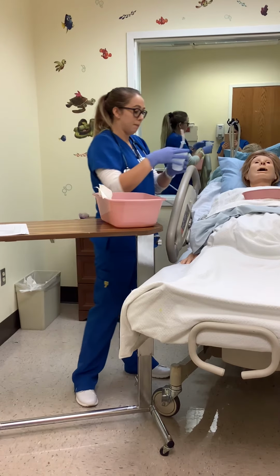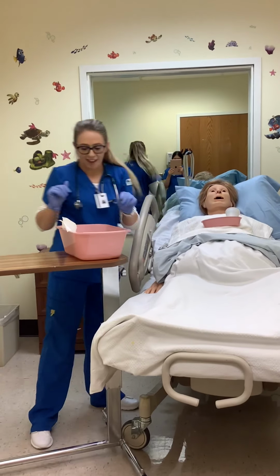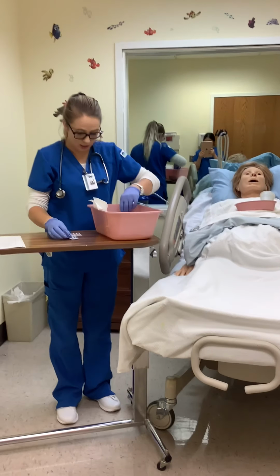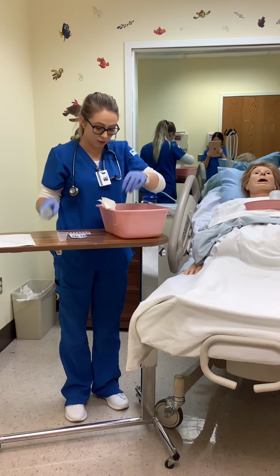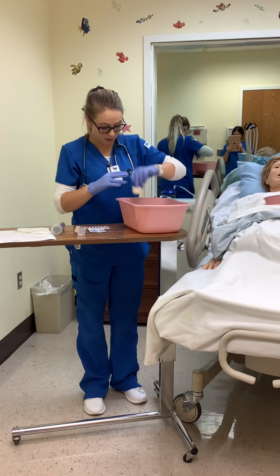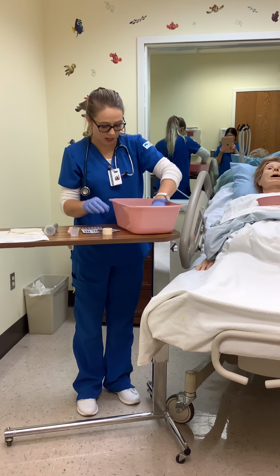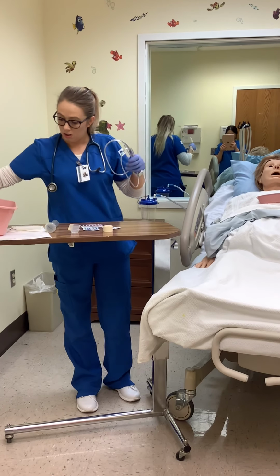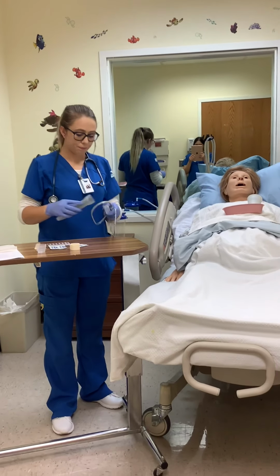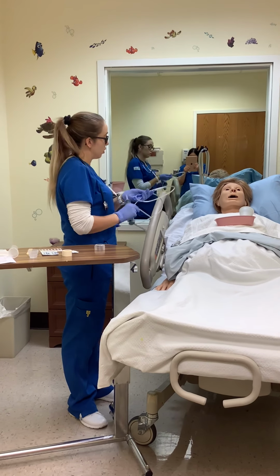Then I will get you a cup of ice water, and that's for you to drink. I have my lube, my cup, my syringe, this tongue depressor, tape. Just getting out all my stuff here. There we go. Okay, Shirley, before I get this going, I just want to go over the procedure with what I'm doing.